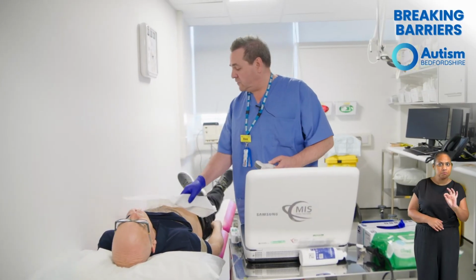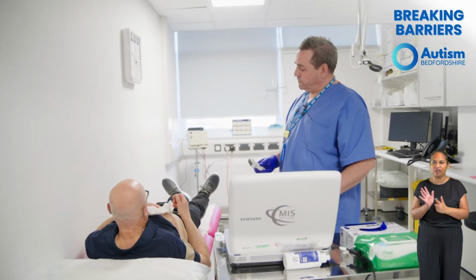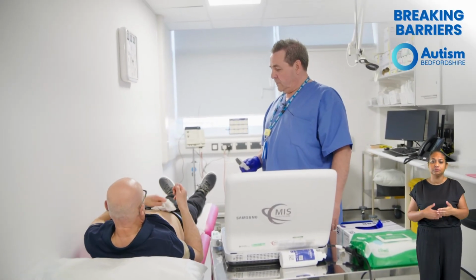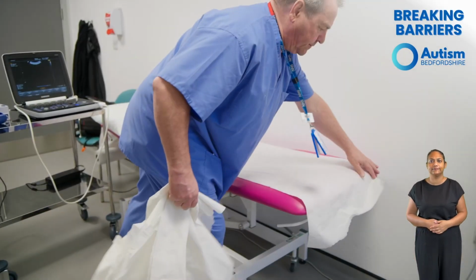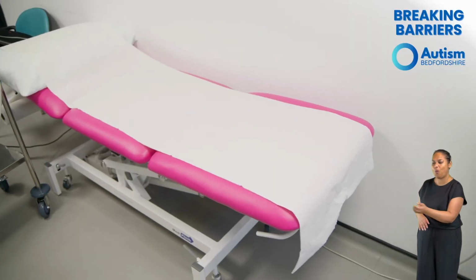If you'd like to take the tissue and just give yourself a wipe down to clean up the gel. The screener will ask you if you need any more tissue to wipe away any remaining gel. You can leave the tissue on the bed and the screeners will dispose of the tissue along with the couch roll.